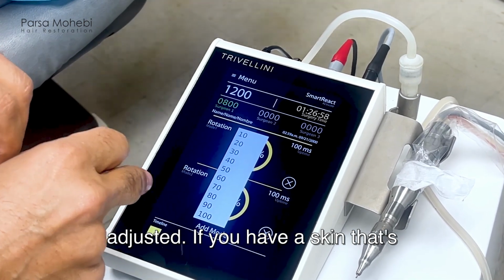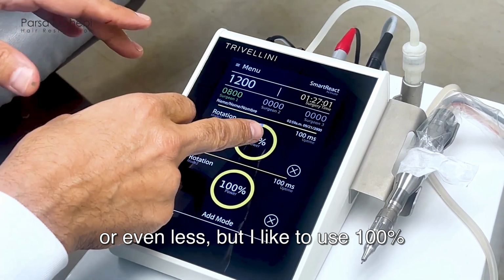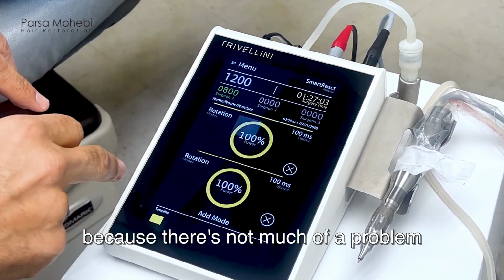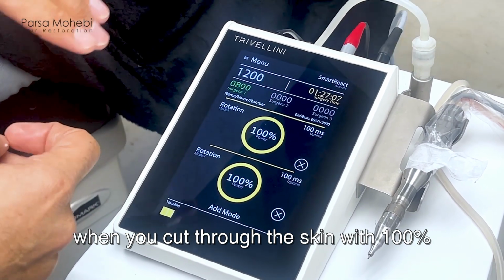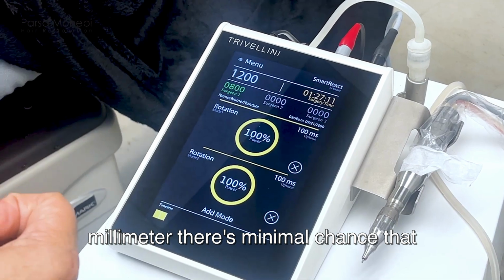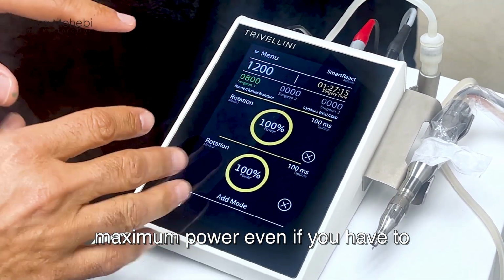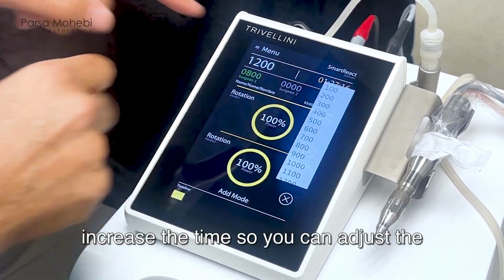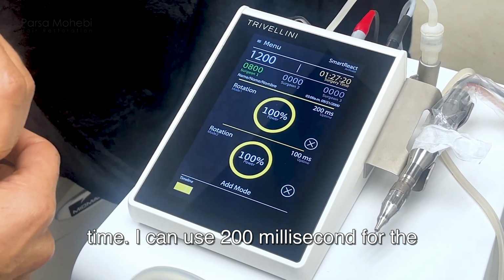If you have skin that's fragile, we can go to 80% or even less. But I like to use 100% because there's not much of a problem when you cut through the skin with 100% for the first millimeter. In the first millimeter, there's minimal chance that you can transect anything. So use the maximum power, even if you have to increase the time, so you can adjust the time. I can use 200 milliseconds for the first phase.